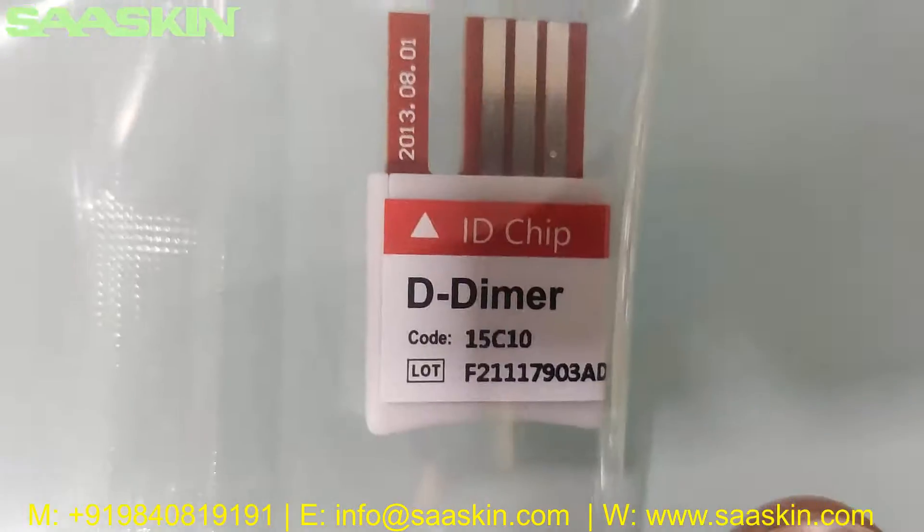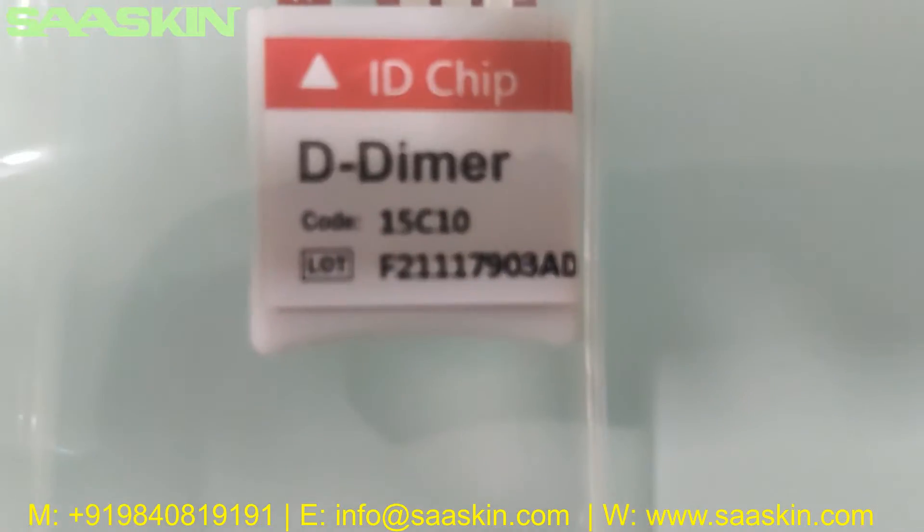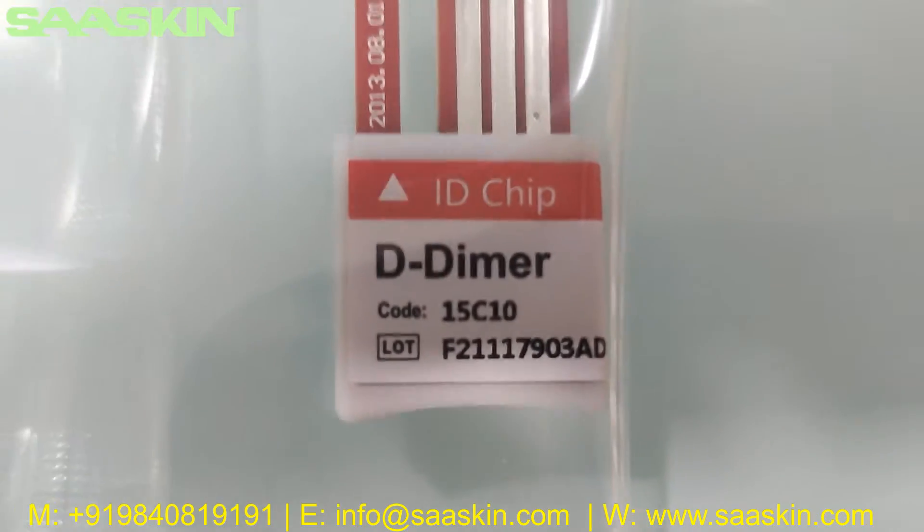You can see it says 'ID chip' on the label. It says D-Dimer, and it has a code as well as the lot number.